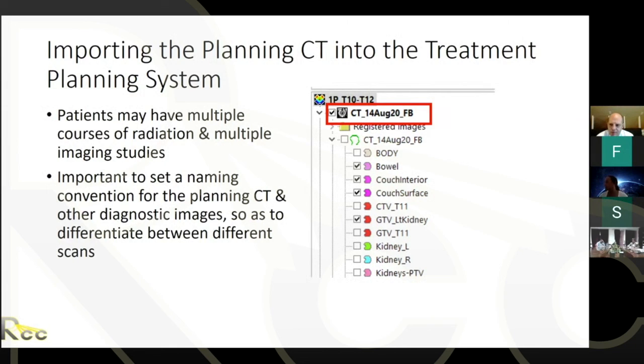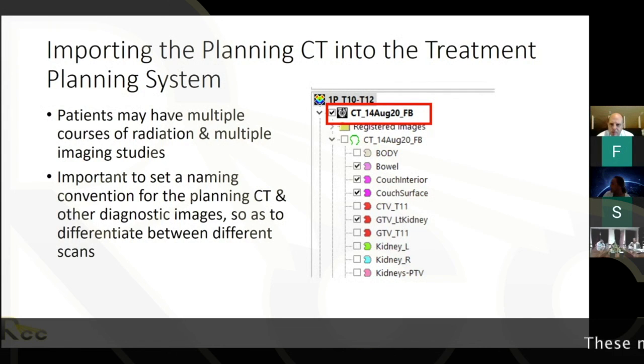Okay. Laura has another question. She's asking about surface-guided radiation therapy. What is the role in CT, or is the role only in the treatment machine? I guess what CT role is there for surface-guided radiotherapy is her question.